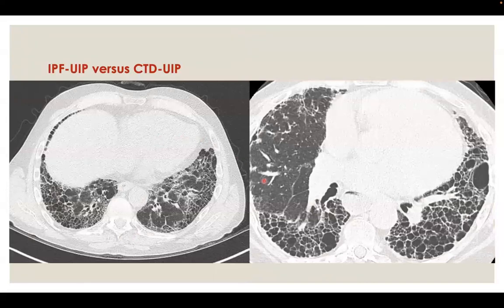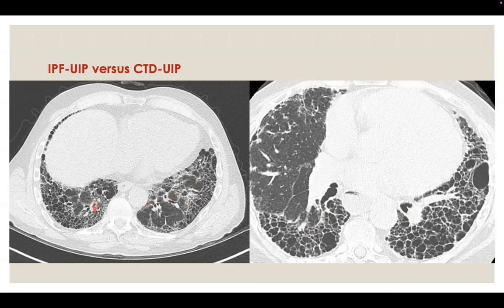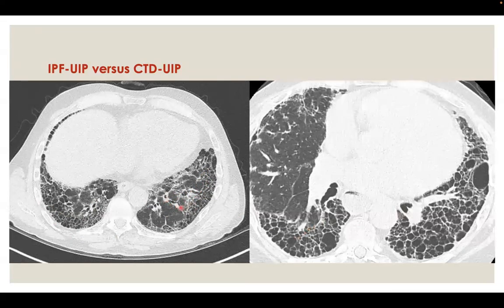This sign suggests secondary UIP because in IPF UIP, honeycombing is significant and is the dominating feature, but not to the extent shown in the exuberant honeycombing sign. In typical IPF UIP, you can appreciate variable traction bronchiectasis, irregular reticulation, and honeycombing — more in amount and extent compared to these features, but more or less there is balance in the presence of fibrosis. In the exuberant honeycombing sign, almost all the findings are honeycombing.